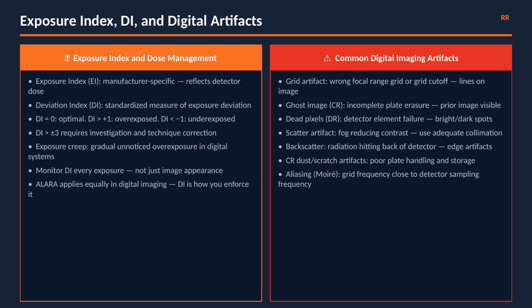Exposure creep deserves special emphasis. As technique drifts upward over months, DI values slowly rise, but because images still look acceptable on screen, no one catches it in real time. Only systematic DI audits across the department identify exposure creep. Run those audits.